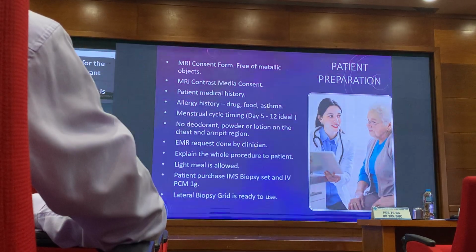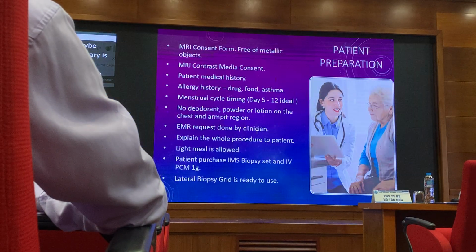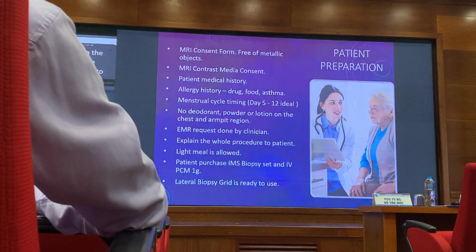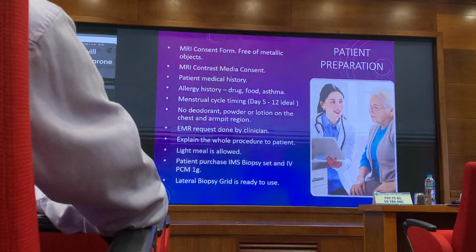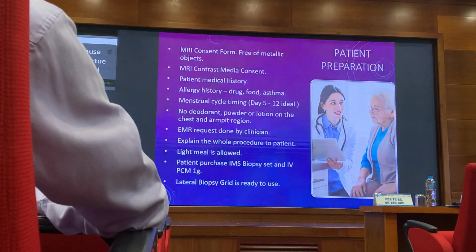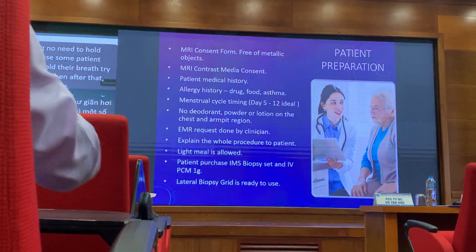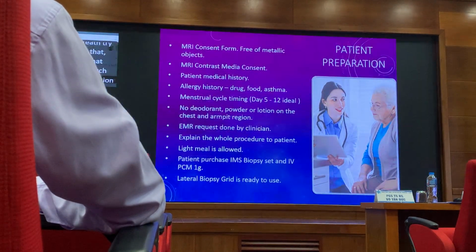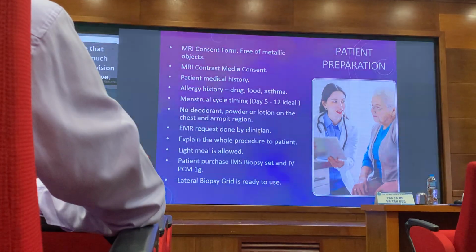We also explain the whole procedure to the patient because the patient might be worried and we want the patient to cooperate with us. Normally I will explain to the patient, you need to be in a prone position and we want you in a comfortable position. Because of the breast at the chest region, we want you to breathe normally. No need to hold your breath, because some patients tend to hold their breath to try to accommodate us. Then the next second it will move, and we are unable to target the lesion and get the right tissue that we want. So explaining the whole procedure and assuring the patient is very important.